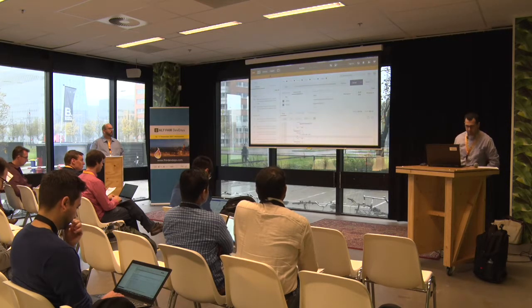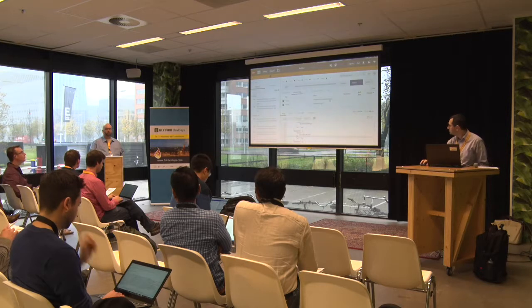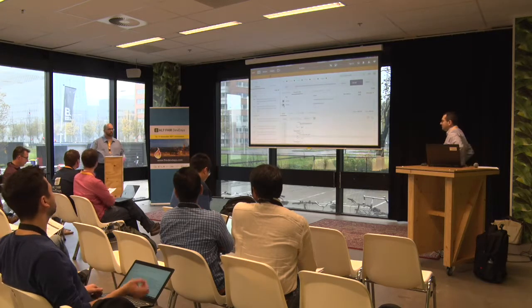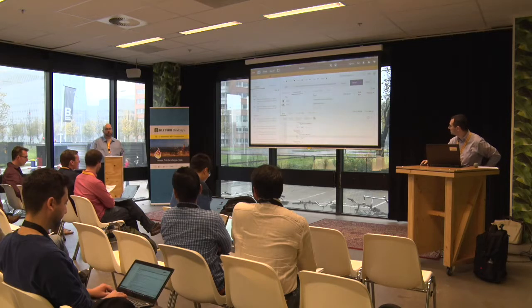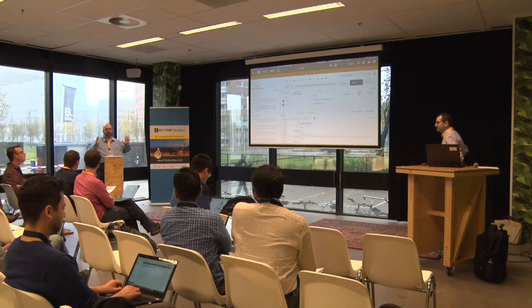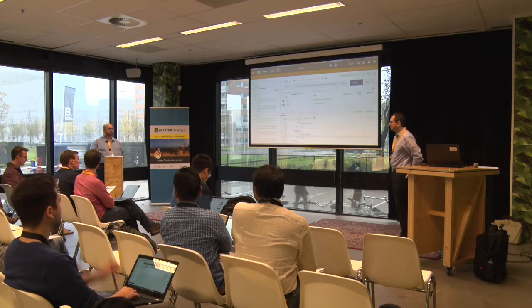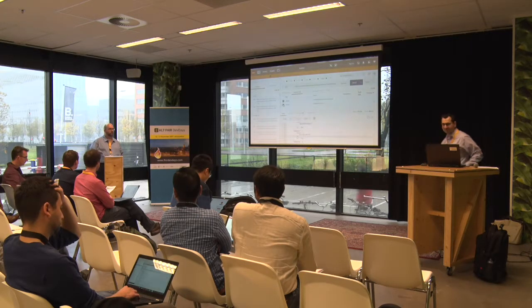I'll say just really quickly, if anyone's curious about this, the DICOM files produced 30 years ago are still valid using the DICOM and DICOM Web standards today. So if you wonder why we would keep these awful tag names, the reason is that it still works. It's not like a database. We actually have these files everywhere, all over the world. And so that's why we have an incredibly backwards compatible way of doing this.